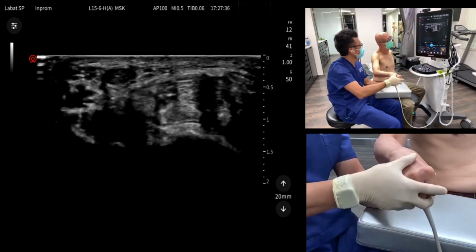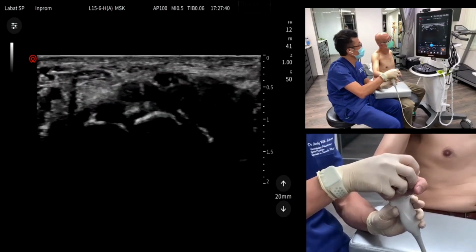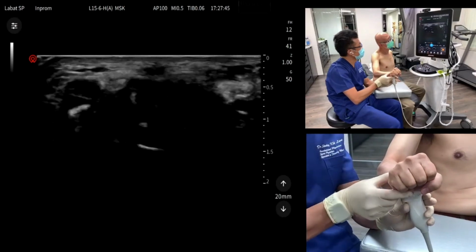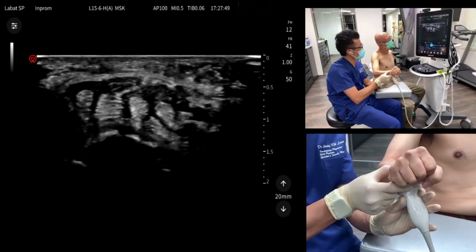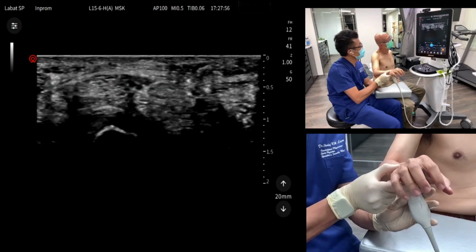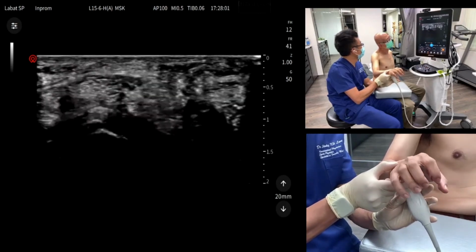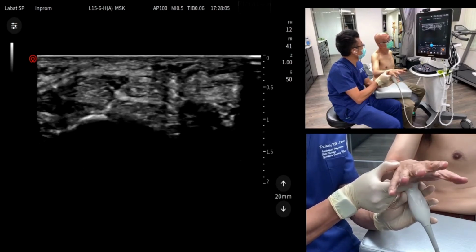Okay, but when you extend the wrist a little bit, and this time squeeze again, and relax, repeatedly. It will not be squeezed. See that? So now your median nerve is safe.